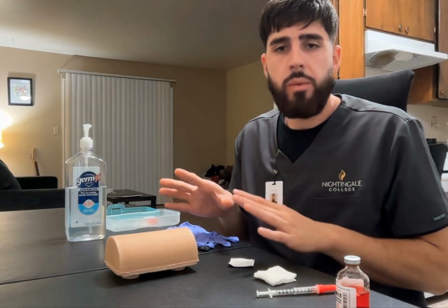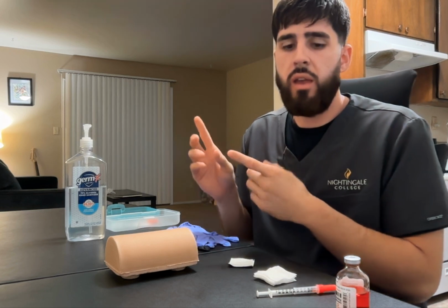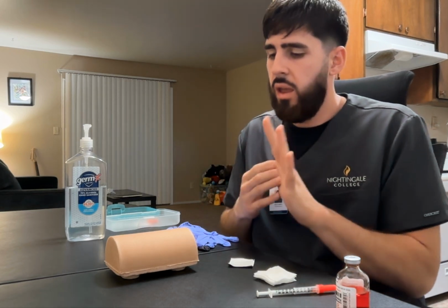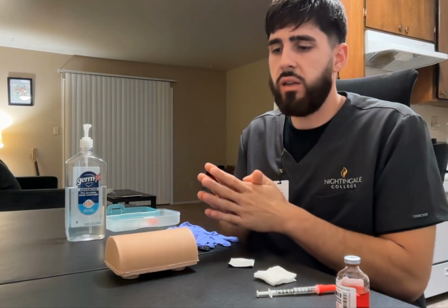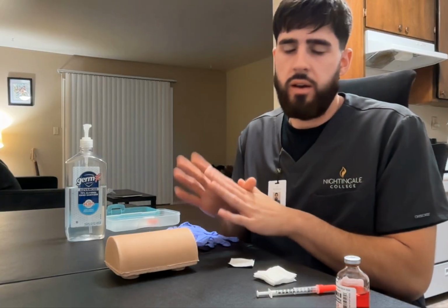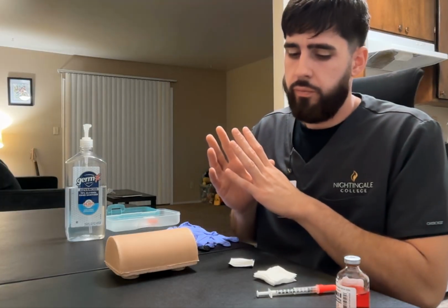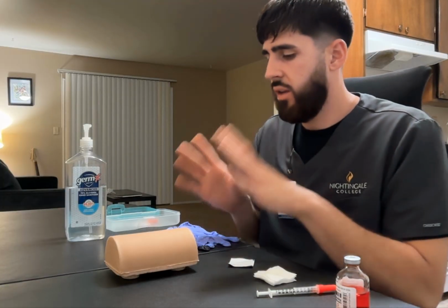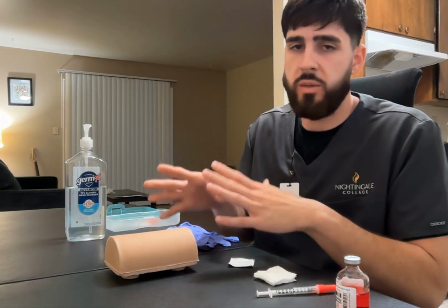And now I'm going to prep Mr. Smith for the injection. At this point in the process, you should have verified the patient, verified the drug, the dose, the route, and given your patient knowledge of the injection. Asked him for any allergies to medications, foods, or environment. You should have your medication ready, and your injection site ready, palpated, and inspected.